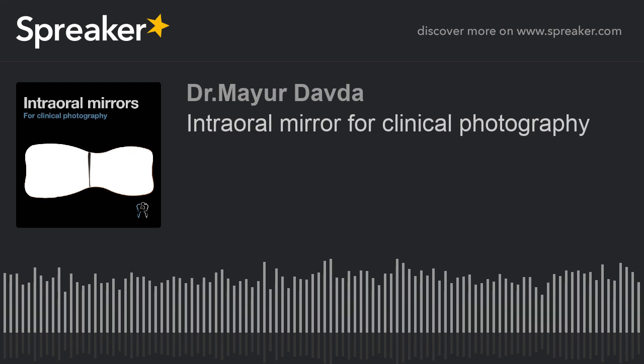Otherwise, you'll end up getting a little bit of distortion, in the sense there'll be a mesiodistal angulation in your pictures. How do we counter mirror fogging? This is also a very important question, and this problem is faced very frequently, especially in cities which are hot and humid. So there are different ways to counter fogging of the mirror.